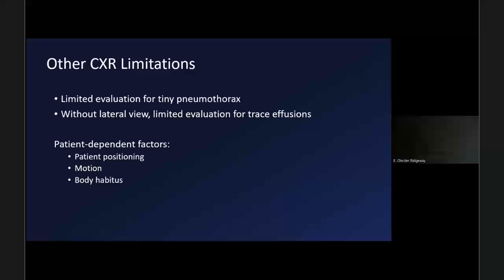Additionally, without a lateral view, our ability to assess for smaller trace pleural effusions is limited a little bit. Even with a lateral view, we can't pick up an effusion that's smaller than like 75 milliliters. So just keeping that in mind as well.